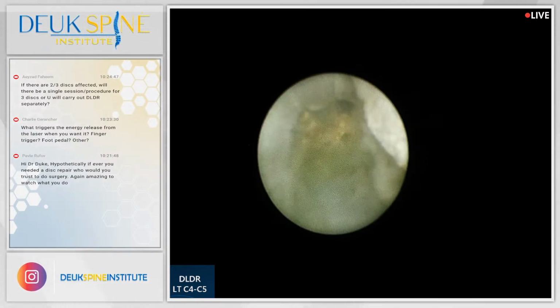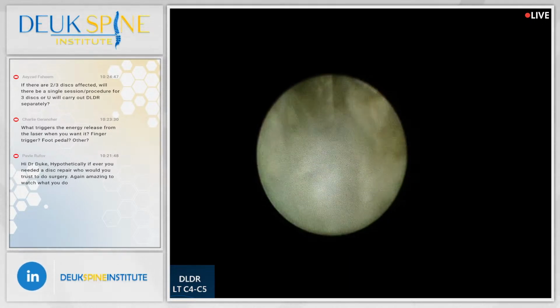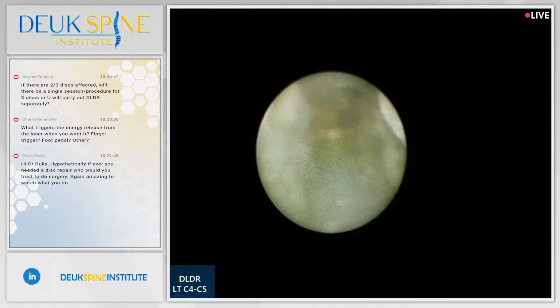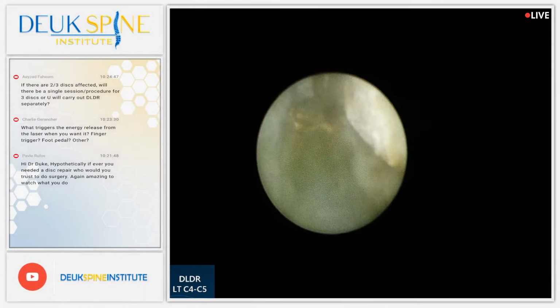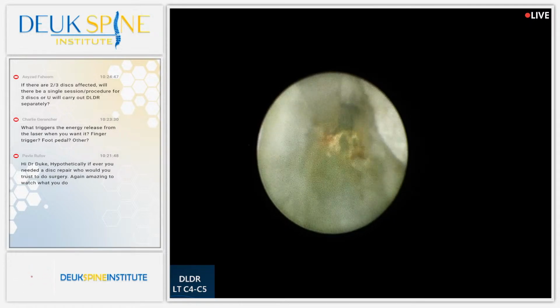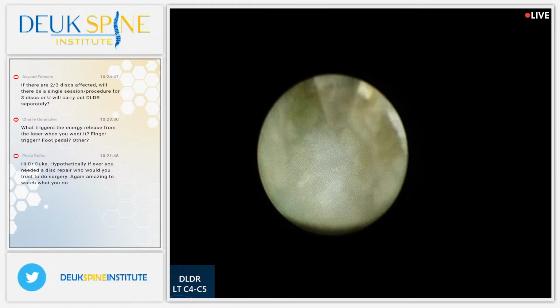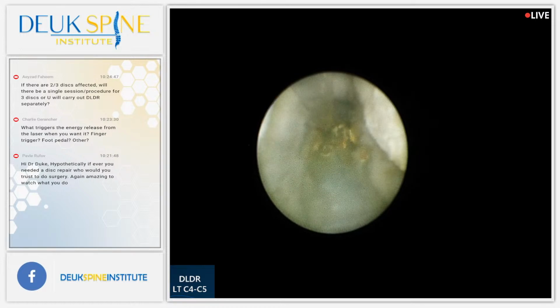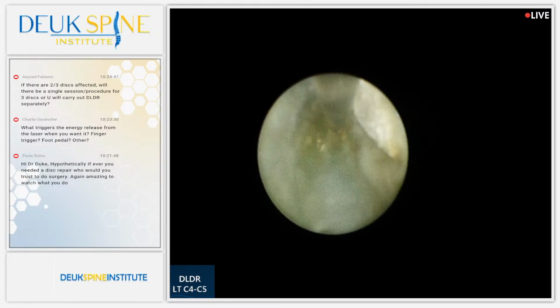But you guys can see the difference, right? This is spinal cord right here, the white, and then here's herniation. It's blue. That's why we use the Duke Spine blue dye. Duke Spine dye is so I can see the herniation. If I didn't inject that dye, guess what? This would all be the same color. It would all be white. That's crazy, huh? So the dye allows me to find the herniation and remove it properly, safely.